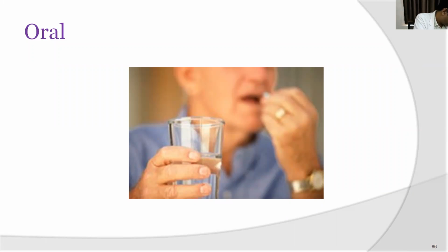Apart from this, what we have is this insulin pen. You have inside this the already formed drug. Okay, and one small needle comes which has to be attached here. And then whatever units you need to take, you have to adjust from this turning thing.